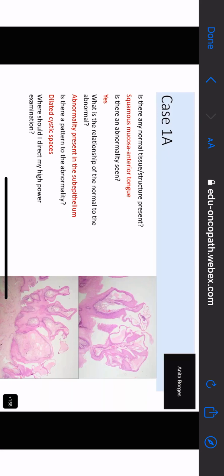Now, the fifth question always is, where should I direct my high power examination? So where would you direct it? Ma'am, to the cystically dilated spaces. The lining of the cysts, right? Yes, ma'am. That's what you would do. Very good. All right.